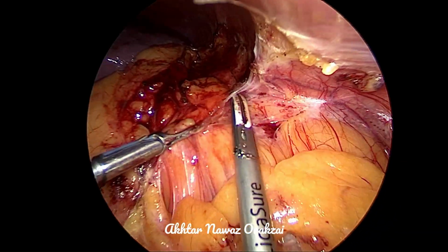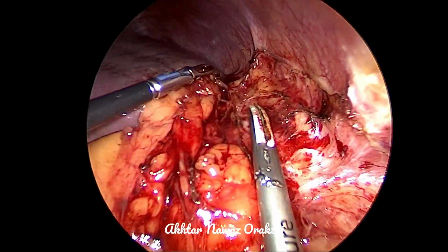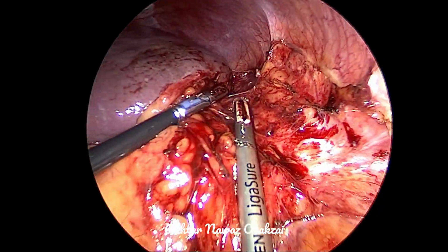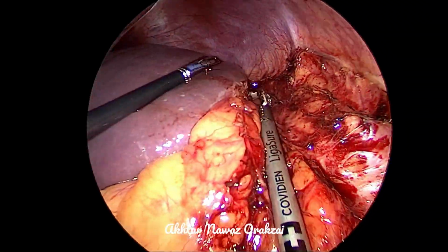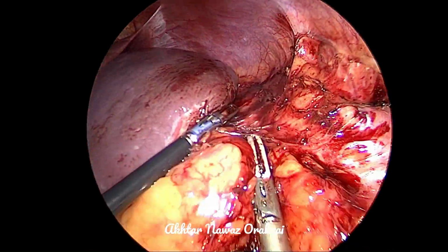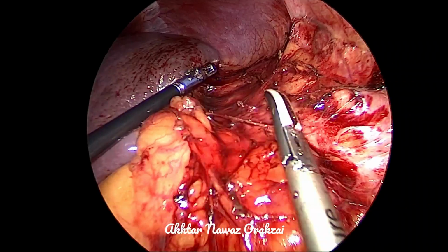So the purpose of sharing this video is the fact that such a kidney is really stuck here and there with the surrounding structures, and its architecture is quite hard, and it's not easy to dissect it. So I thought it might be helpful to share this video and see how the structures around are. Especially dealing with the pedicle is quite difficult in such cases.